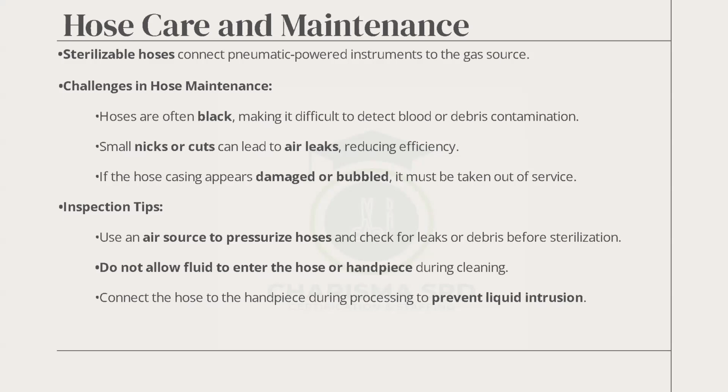All right. All of these items are most of the time hand washed, but that is not to say that the manufacturer cannot say it can go through the washer. Where the manufacturer says so, do it as instructed. But most of them are hand washed. Next slide, Director.